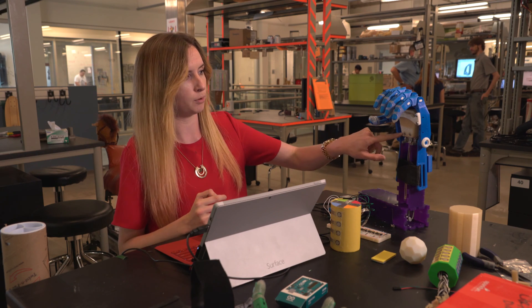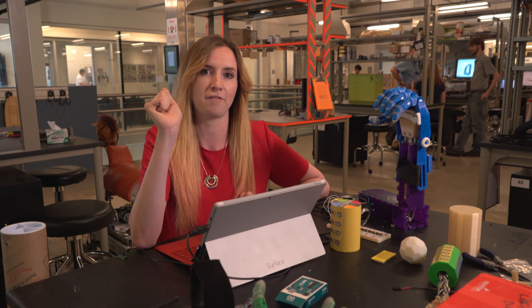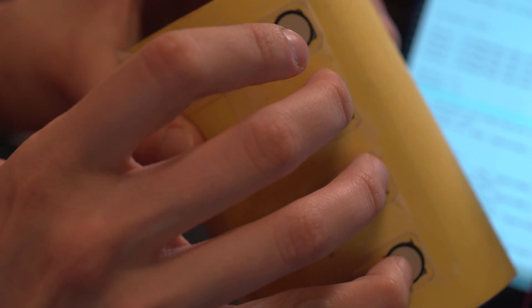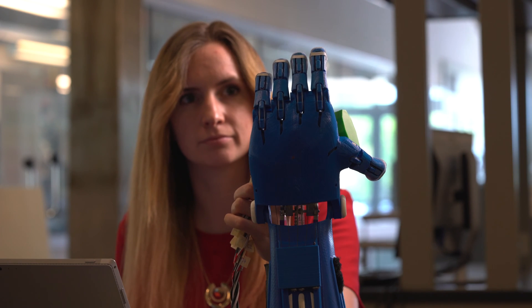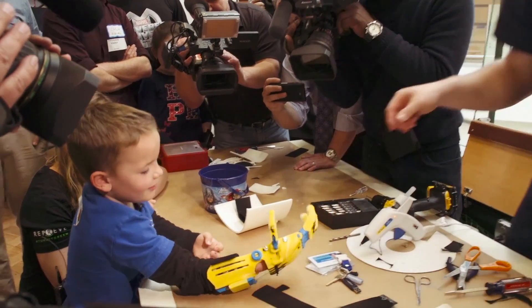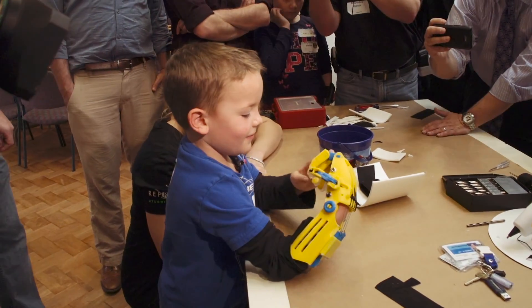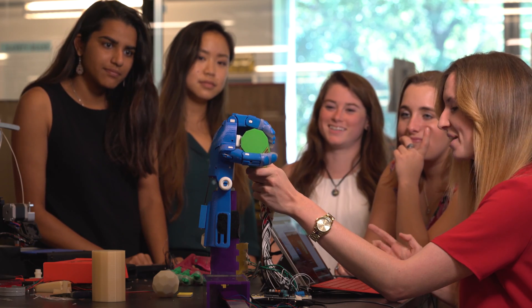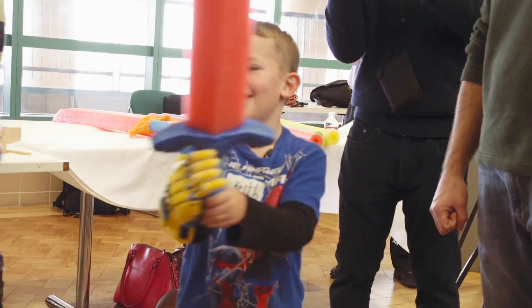It also has a force input — how much pressure you have to put into the hand — and force output: how strongly is it gripping these objects? The goal of this project is to give more information to the prosthetics community in general. This project is so great because it's working with people that are just in it for the love of helping and new technologies, and understanding more about the ways we can be fabricating prosthetics.